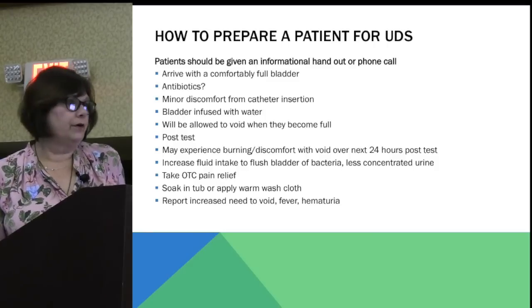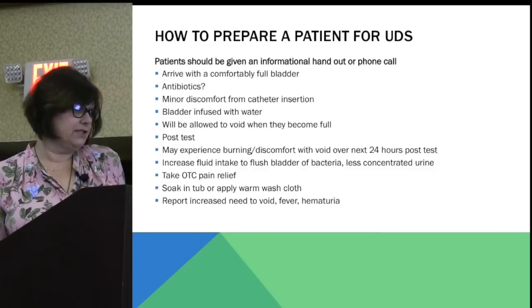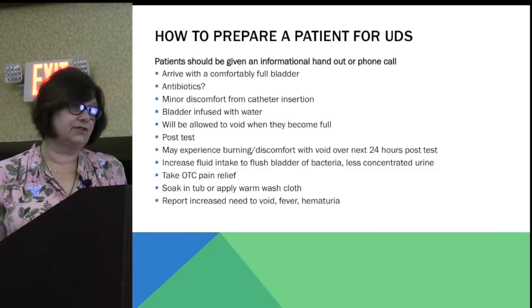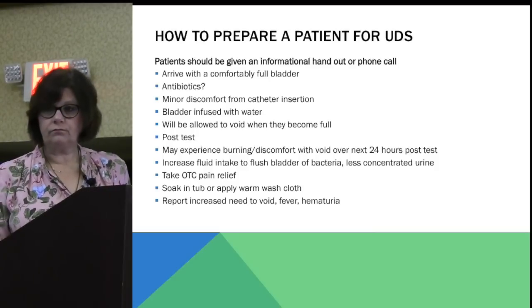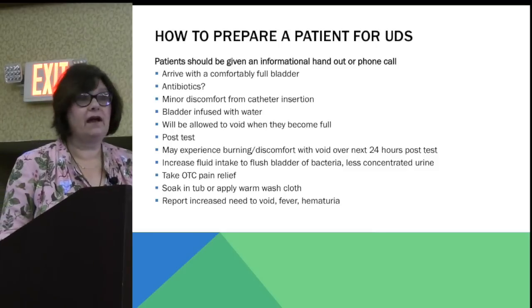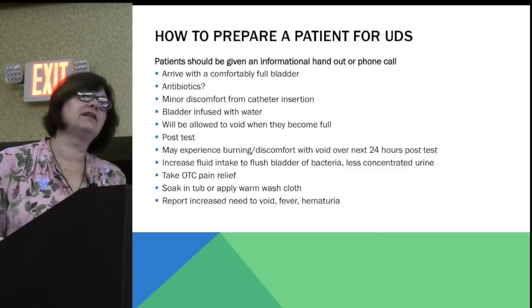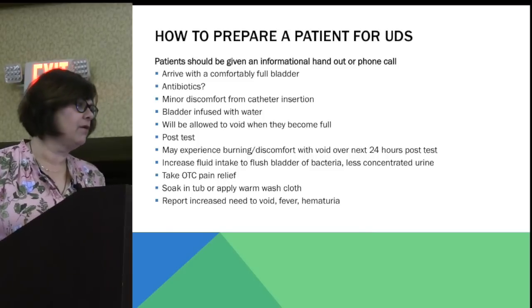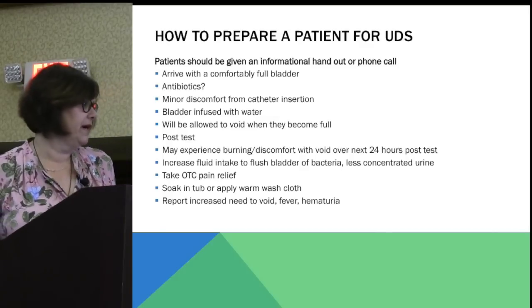instructions. It's possible that you could see a little bit of blood in your urine. It's possible you could get a fever after this or have really bad urgency and frequency. You need to call us with those situations so that we can test you for a UTI and get you appropriately treated. The other thing is to have them increase their fluid intake immediately after the test for the next 24 or 48 hours or so, to flush the bladder of any possible bacteria.